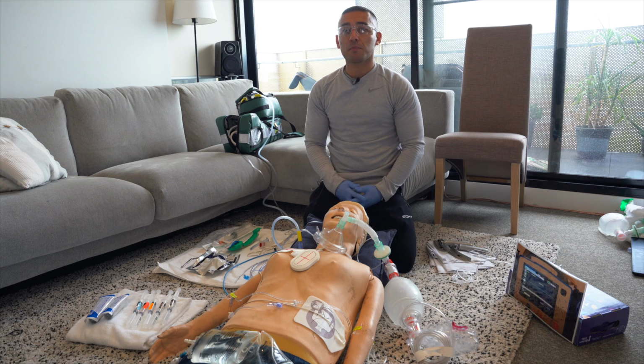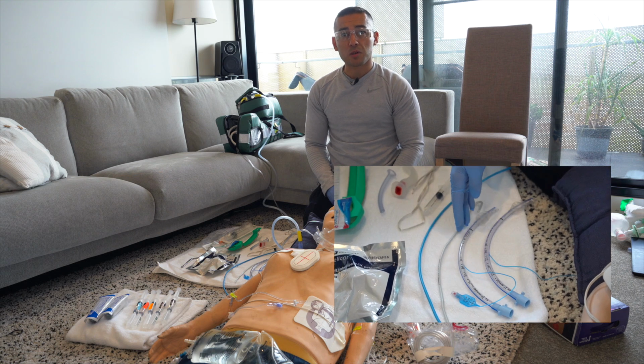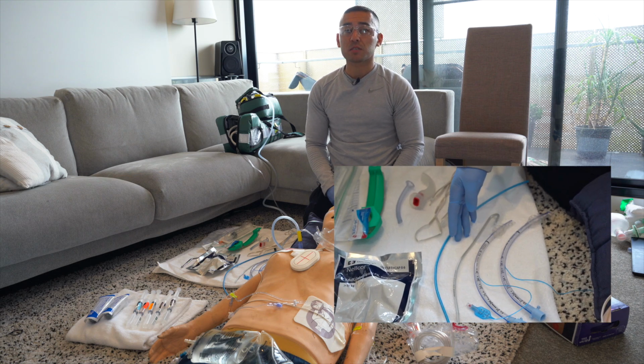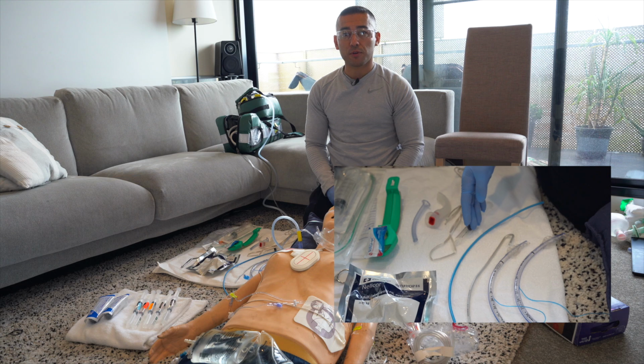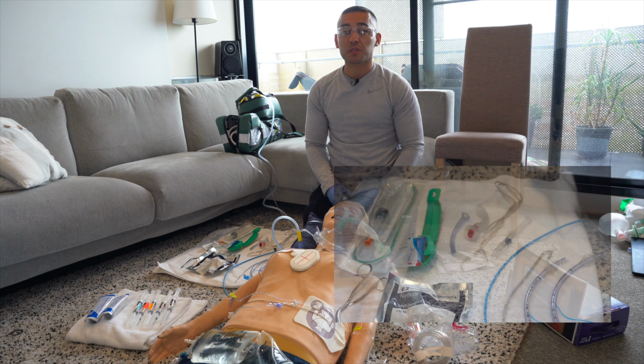On the right-hand side of the patient's head will be the remainder of the airway equipment, which should be laid out in the order in which you may use them. That is, start with what you know will definitely be needed, such as the endotracheal tubes, and then place the remainder of the equipment in the order in which they appear in the difficult airway guideline. So here we have the predicted size ETT plus 1 size smaller. Next is the stylet and bougie, which may or may not be utilized depending on the airway anatomy and grade of view. There's a 10 ml syringe to inflate the cuff and tube tie once tracheal placement is confirmed.